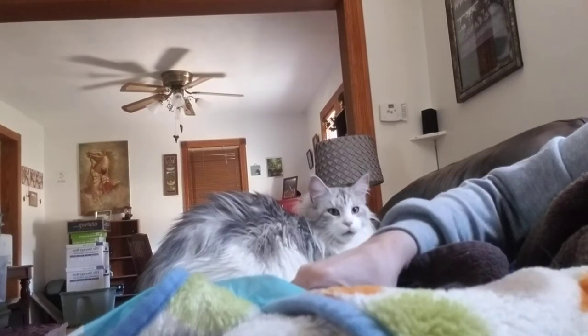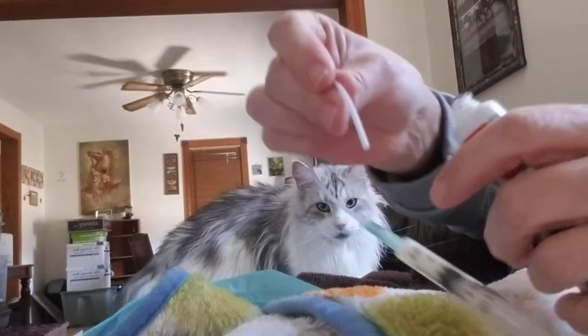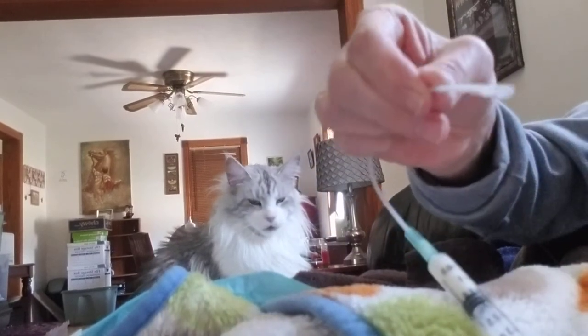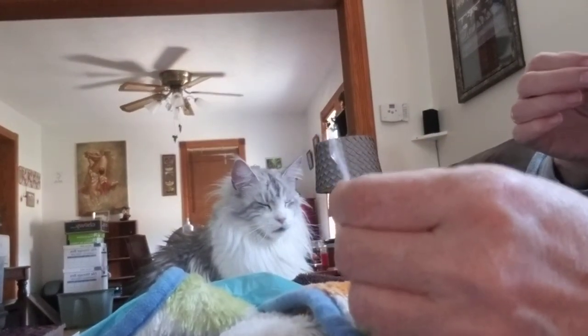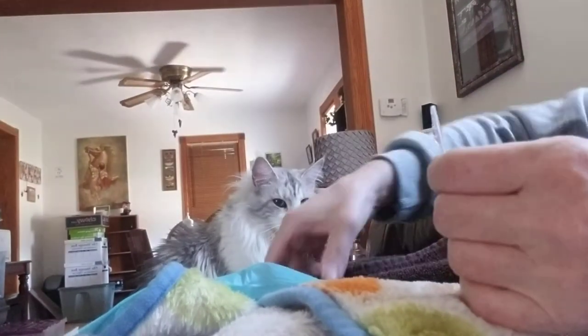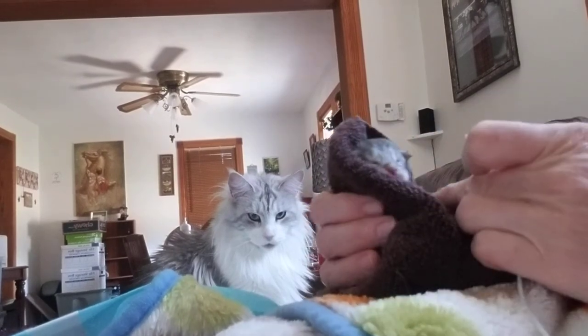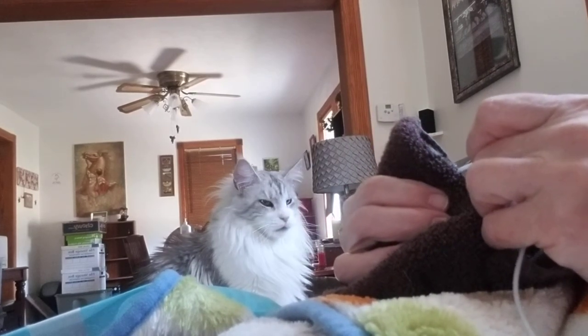We have one more to do yet, so I will demonstrate once more. So I'm going to take my tubing. Again, I'm going to put this nasal gel on the tip of it so it's lubricated. Can you see that? Probably hard to see. Well, anyways, come here, little one. I'm doing this just for two of them every 2 hours, and then the other two are bottle fed. The one I just did was suckling, but not very strongly, so I'm helping it out.